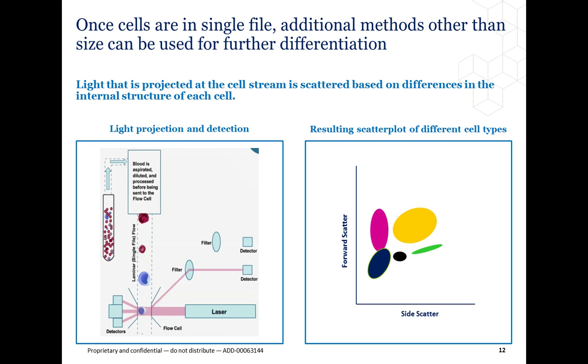If the concentration of the cells is too high, or the stream speeds are not optimized, there can be a detection of doublets or a longer irregular signal that could represent 2 cells in close proximity passing at the same time, very similar to what we saw in impedance. Therefore, it's important that both the dilution and injection speeds are optimized, and that's what the designs of the new systems are set to do.